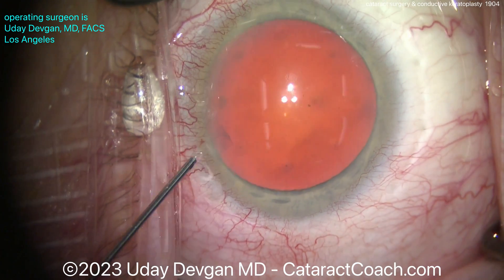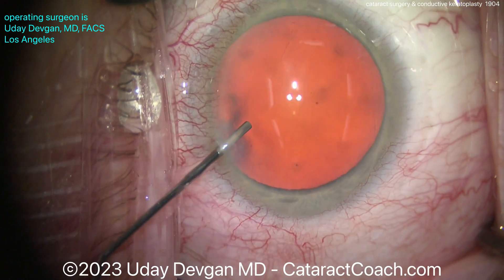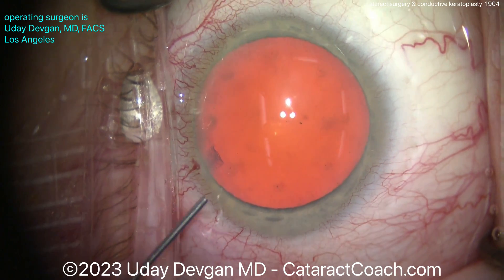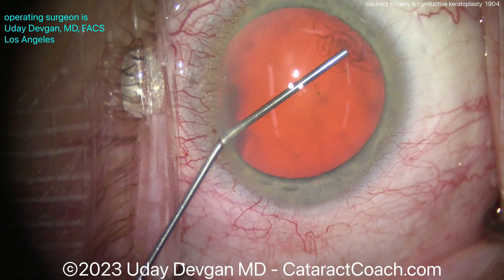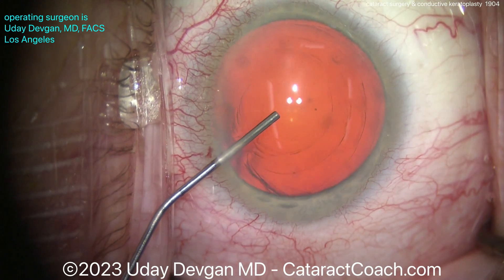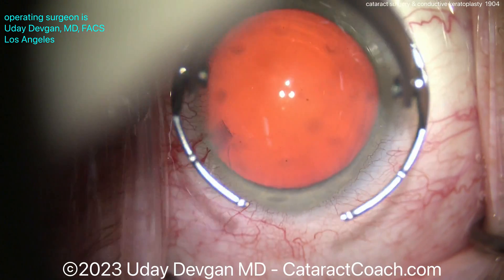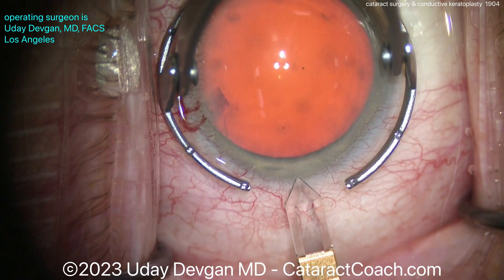This was done typically in the non-dominant eye of a patient — let's say a plano-presbyope — in order to induce some more near vision. If you increase the corneal power from, say, 43 diopters to 44 diopters, you had about a one diopter refractive shift. These patients could do very well initially, but the effect tended to wear off with time.